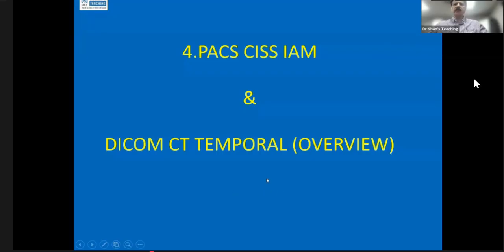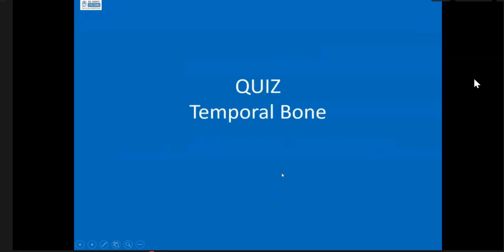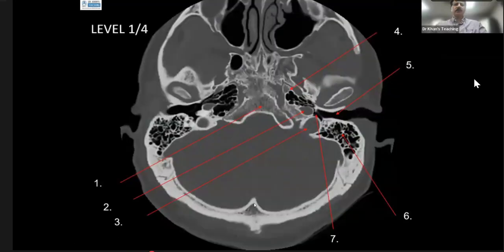Can you see my blue slide? Yes. Okay, now this is open for chat. So this is a final repetition. I think I've got 4 slides here. It's a quiz, and everybody can participate. This is open for chat, and I'm going to ask one by one. So, answer number 1, what is this?